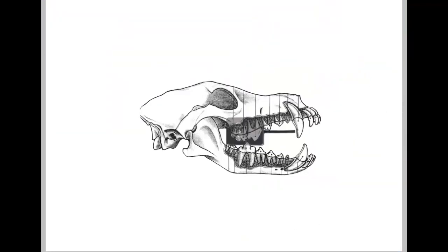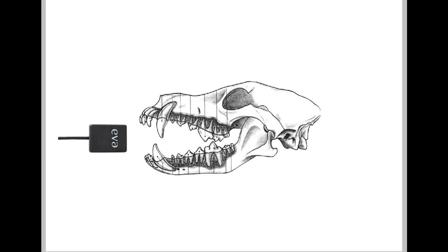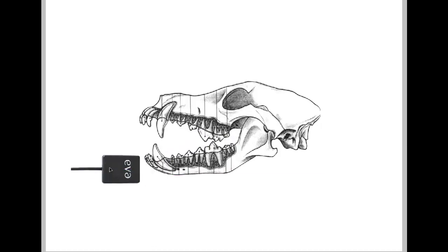So again, if I want to illustrate taking shots on the left side, for instance, if I'm going for the quadrant 2 and 3, say molars or premolars, my sensor would be in this position. It would be in the landscape position, and we would place it for the upper teeth either here or here, and for these lower teeth we may place it here or here.